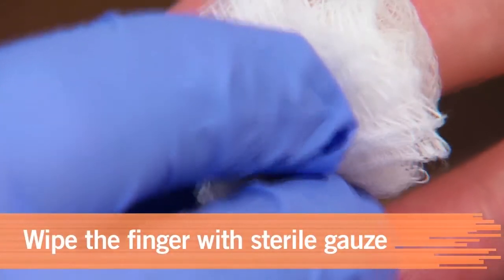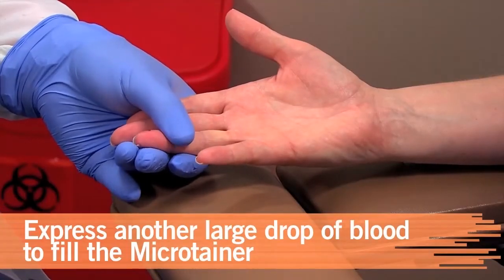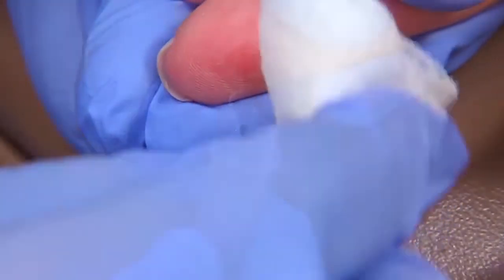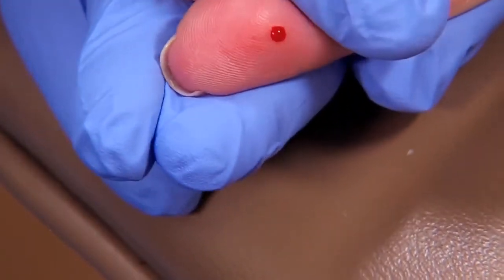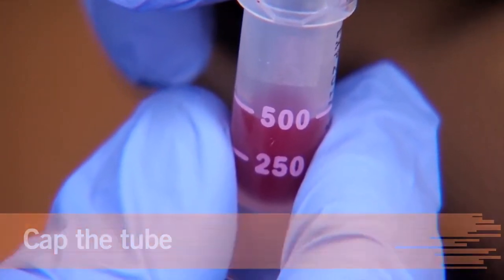Wipe the patient's finger with a clean, sterile gauze pad. Express another large drop of blood and fill a microtainer. Don't touch the container to the finger. If more blood is needed, wipe the puncture with sterile gauze and gently squeeze another drop. Then cap the microtainer tube.